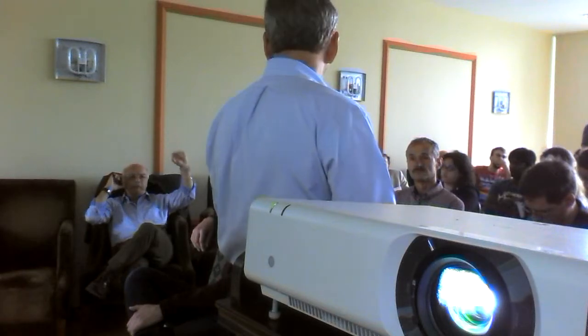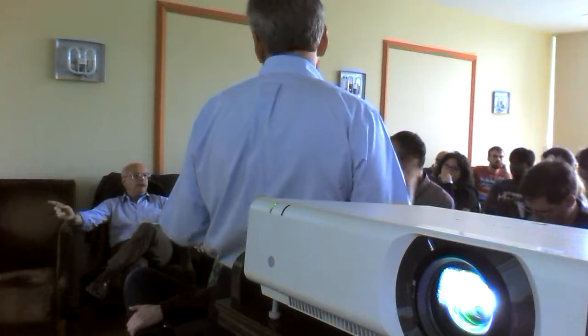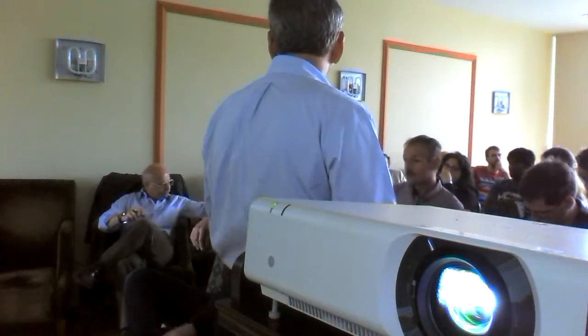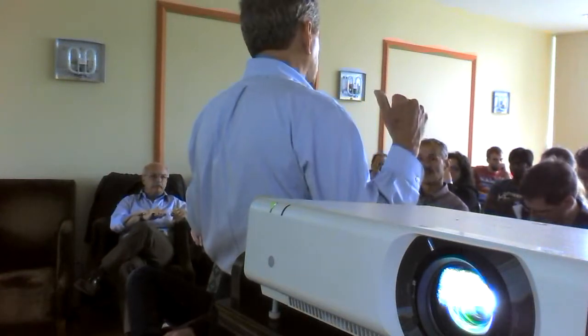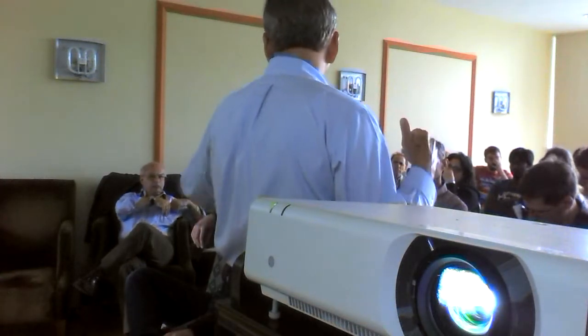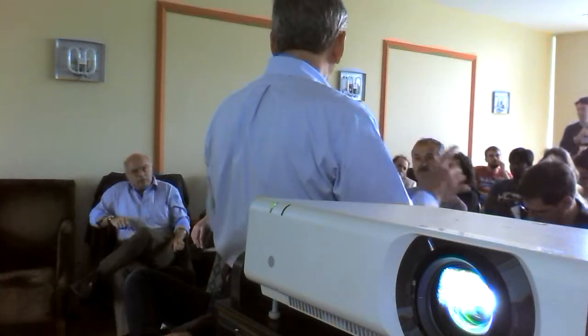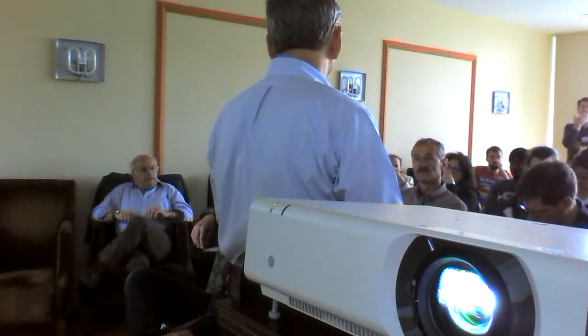But the absorption depth is going to change if the absorption profile changes, so that is going to change. Oh, yeah, the spectrum of your signal. Yeah, but because we're with these short pulses, we're working in this thermal confinement regime. It's more just a typical absorption and shadowing and those types of things. I don't think there's going to be effects related dramatically to the pulse length relative to wavelength.